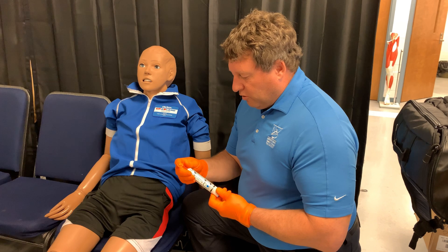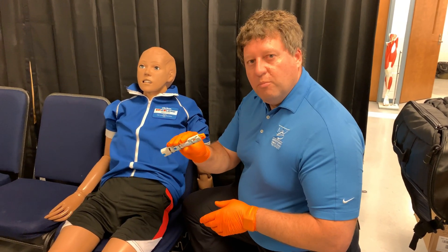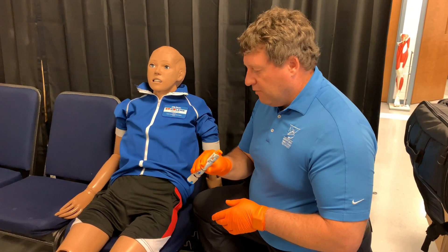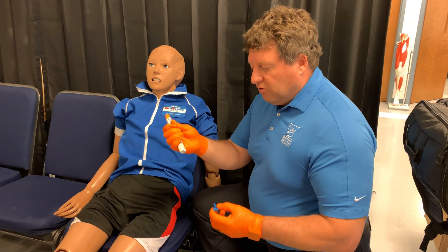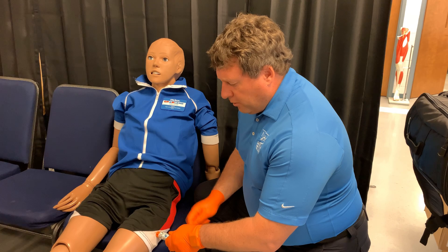So we are going to do this the proper way. He's having his allergic reaction. I have his epinephrine pen, which is going to administer 0.3 milligrams of epinephrine intramuscularly. I release the safety, find the middle of his thigh, and tell him it's going to hurt.